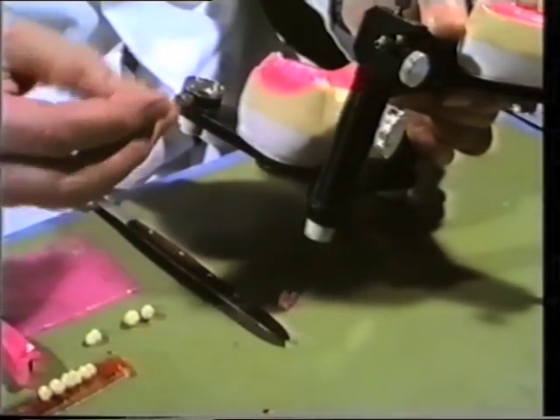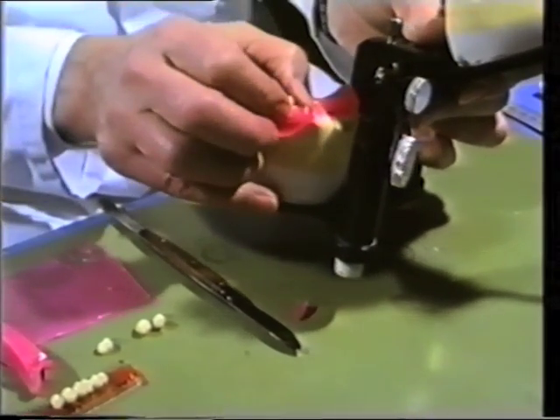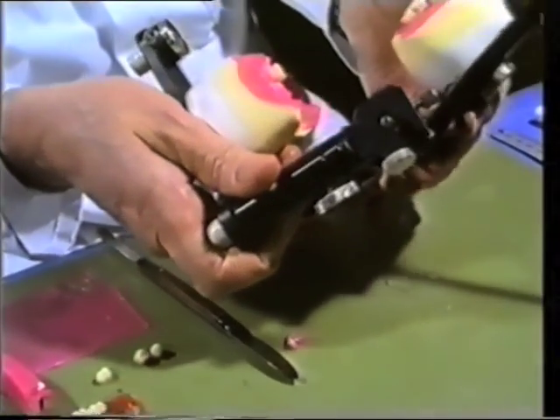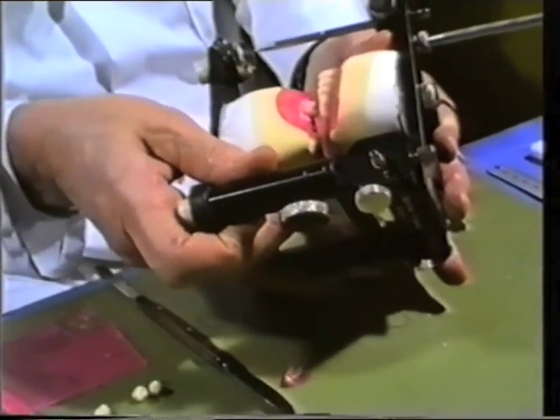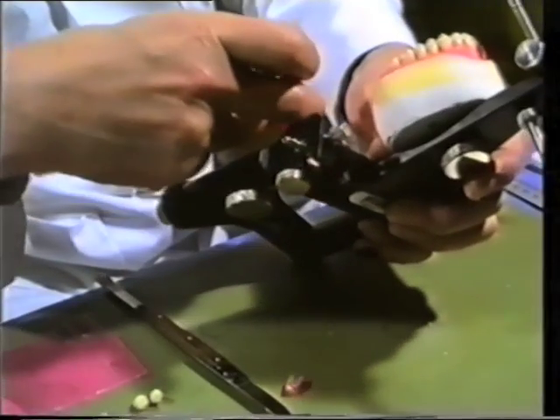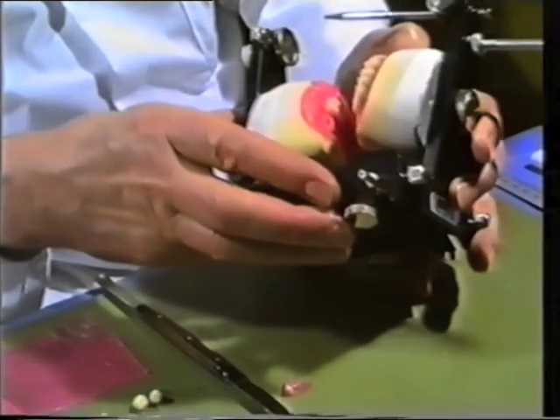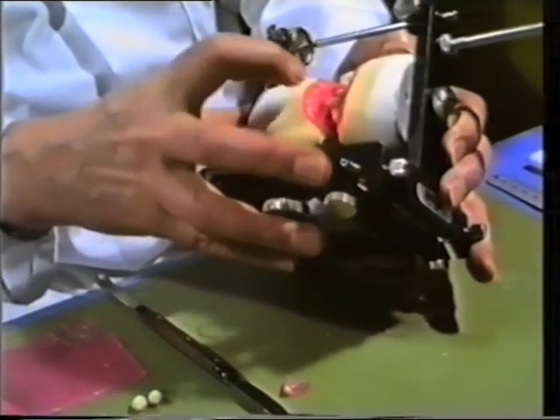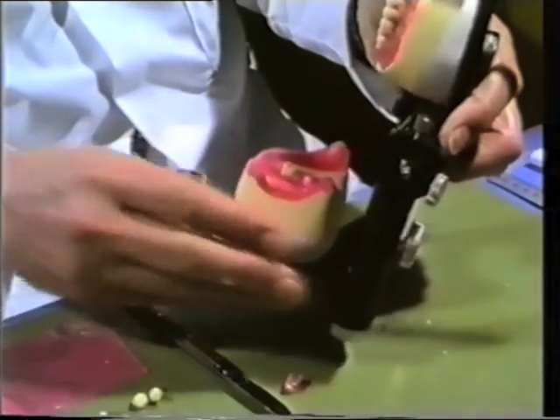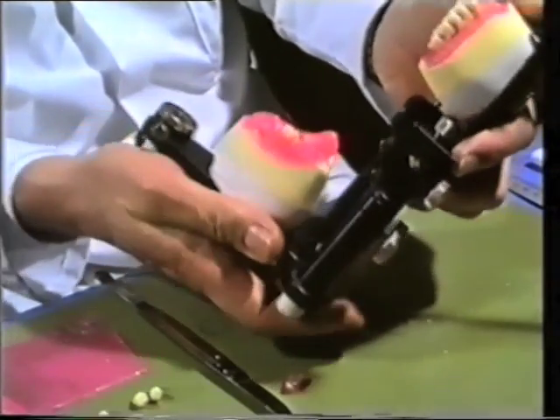The first tooth to be positioned is the mandibular first molar. It is placed into maximum intercuspation and adjusted for balanced articulation. Both lateral and protrusive movements are made to establish working, non-working and protrusive balancing contacts.